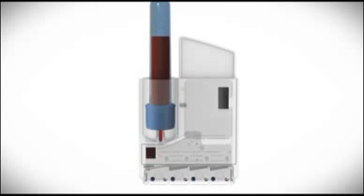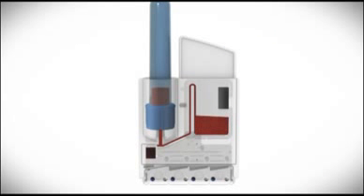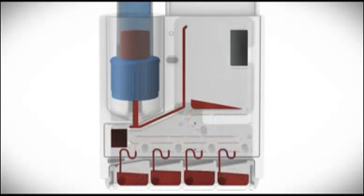From here, the sample is aspirated into the staging well. The staging well heats the blood to 37 degrees Celsius. After heating, the staging well is pressurized, and the blood is pushed out of the staging well and into the 4 mixing chambers simultaneously. Contained in each of these chambers is a chrome-plated mixing ball and a pellet.